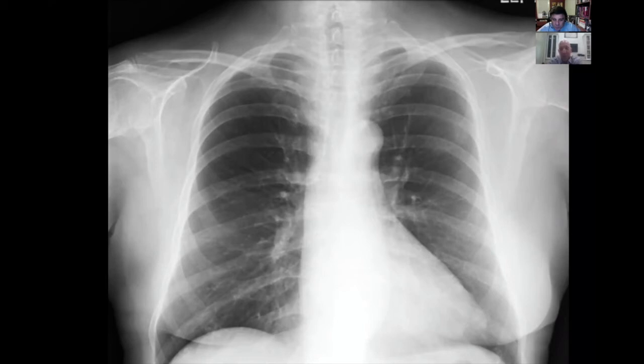And in this case here, you can take a look again, Frank, and see if anything catches your eye. Really, I'm looking at the lung fields, and it's again not particularly impressive. Maybe the right hilar area, maybe a little congestion there, but this is an underwhelming film for me. I'm not ready to call a pneumonia on this one. I don't see anything. Well, this is much more subtle than the other one, but I just wanted to show the spectrum of how subtle these can be.